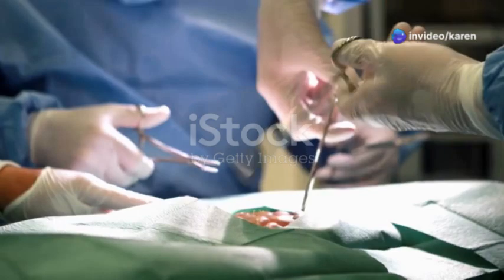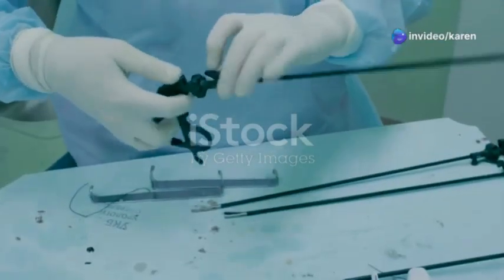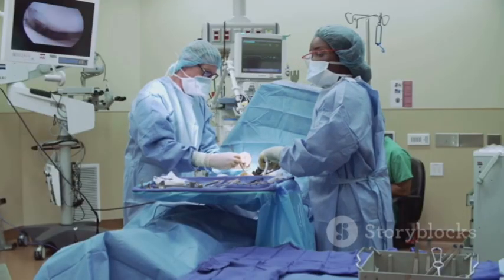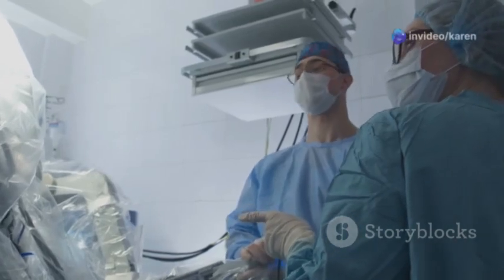Perioperative nursing students need specific skills and knowledge related to sutures and needles. They need to know how to prepare suture materials. They also need to know how to assist the surgeon during suturing. This includes passing instruments and maintaining a sterile field.